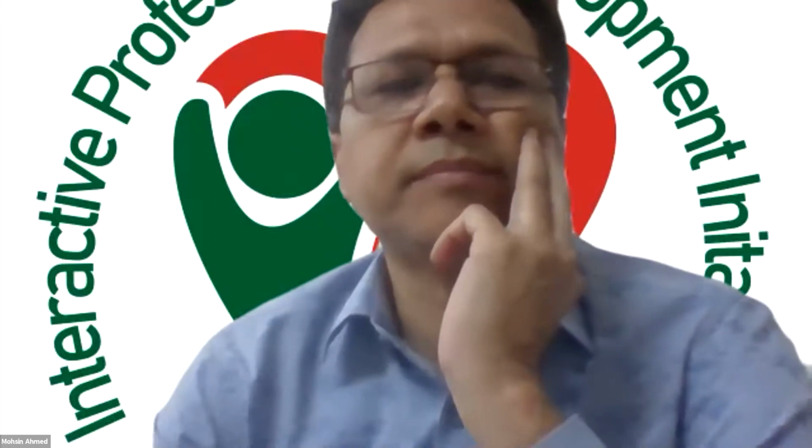Dr. Arun, please. No, I was just saying, those were beautiful points by Dr. Saidur. And I'll just say, don't pick like 30 millimeters or 40 mil. Pick a tapered proximal cap. If you're looking at anatomic stuff, lack of calcification would be very helpful. And short CTOs. If you're cherry picking your cases, those would be your highest likelihood of success.